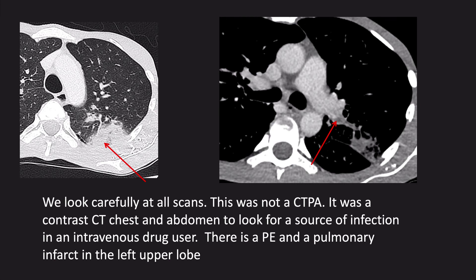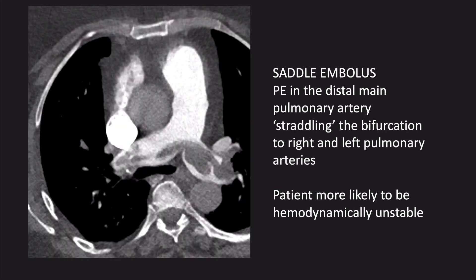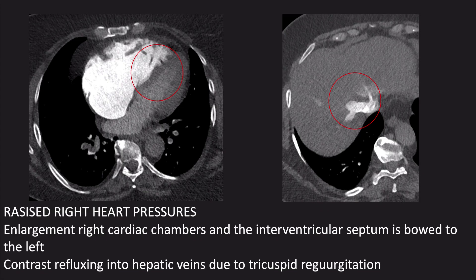It's important to remember that pulmonary emboli can turn up unexpectedly on contrast CT scans not performed as a CTPA — PE is common in oncology patients. This example is of a CT to look for a source of infection in an intravenous drug user; there is a PE and pulmonary infarct in the left upper lobe, sometimes seen when the patient has an infected DVT from injecting into the femoral vein. Where a PE is seen in the main pulmonary artery crossing the bifurcation into the right and left pulmonary arteries, it's called a saddle embolus. Patients with a large central clot are more likely to be haemodynamically unstable. We can assess for instability by looking for features of raised right heart pressures: enlarged right heart chambers, the interventricular septum bowed into the left ventricle, and contrast refluxing down the IVC and into the hepatic veins due to tricuspid regurgitation.